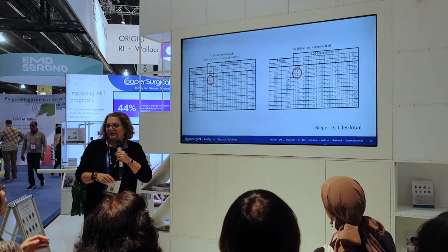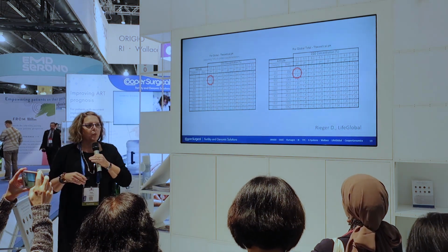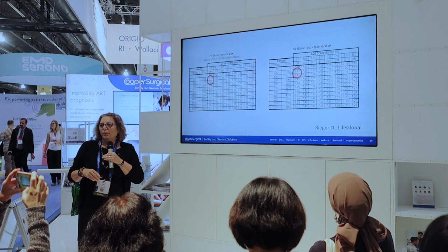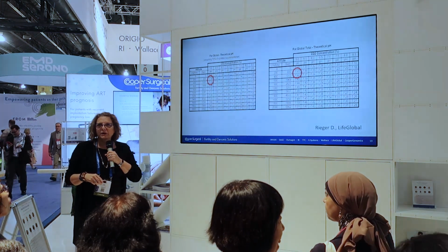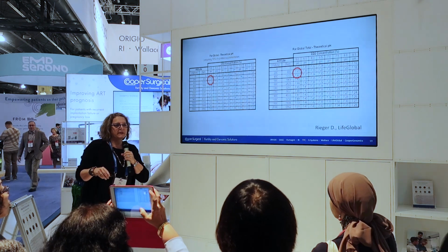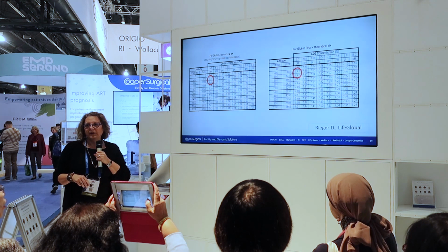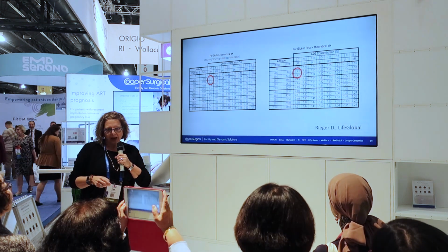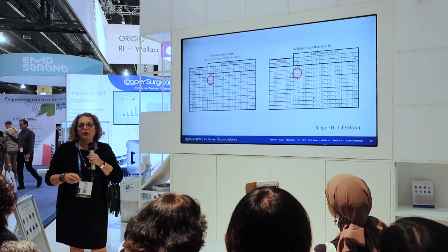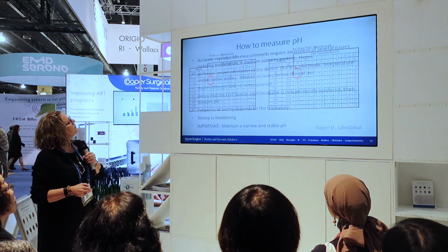And what about altitude? This is why it's important not to talk about what we're going to set our incubator to, but where are we? Altitude has an important part to play on pH. Someone in Denver is not going to have the incubator set up the same way as Philadelphia. Altitude plays a huge impact. So you need to be aware of where you live and how you're going to set up your incubators.